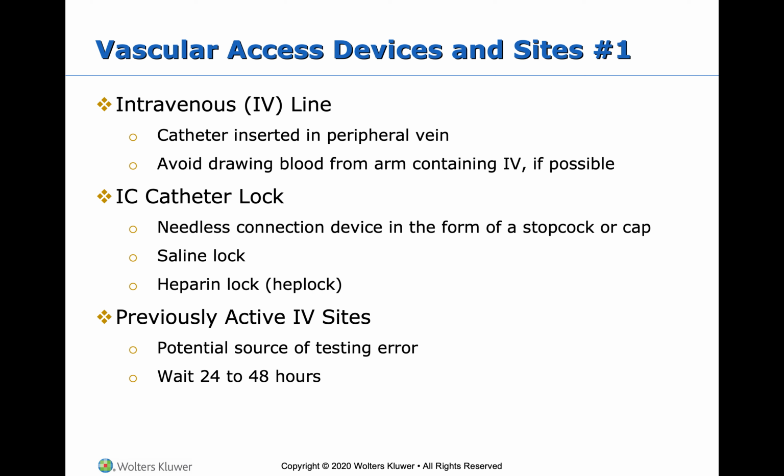They say 2 to 5 minutes. I usually go 5 minutes just to be safe, because I have drawn a patient before and waited a few minutes, like around 2 minutes, drawn above the IV, and had to go back later and poke them again because the sample was still contaminated with that fluid that was running through the IV site. So 5 minutes to be safe, I would say. Anything else I want to say about that?